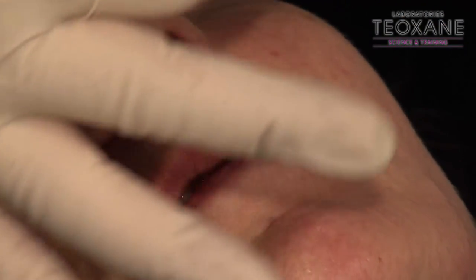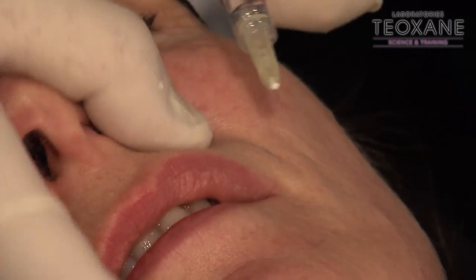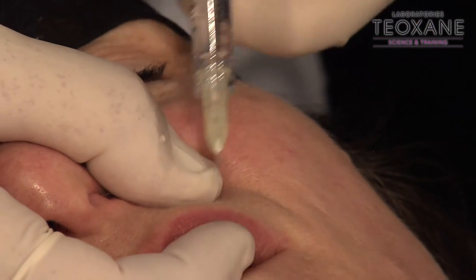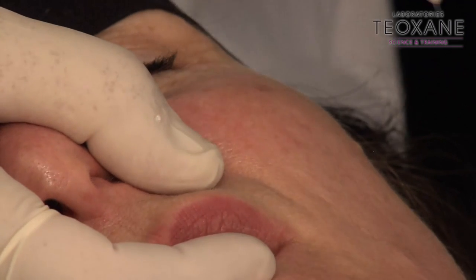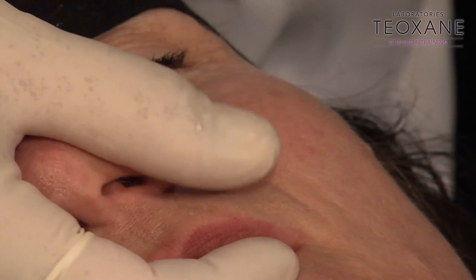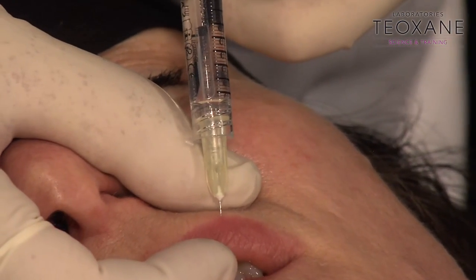So I'm going to put my needle slightly differently. I reverse the lip. Okay, I go in with my needle. It's a 4mm needle. It's very important. Okay, forgot to tell you that. It's a 30 gauge by 4. You have different sizes of 30 gauge. You have 30 gauge by 4, by 6, and by 12. The classic is by 12. This is the 4 one.